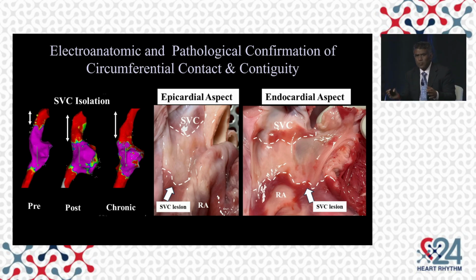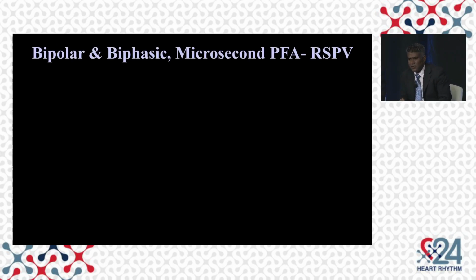And I think this is where PFA allows us to get a much higher degree of durability because there's not a lot of room for gaps to occur in a lesion set like this, unlike RF, which are circles trying to meet in the middle. So I think that's a key concept.